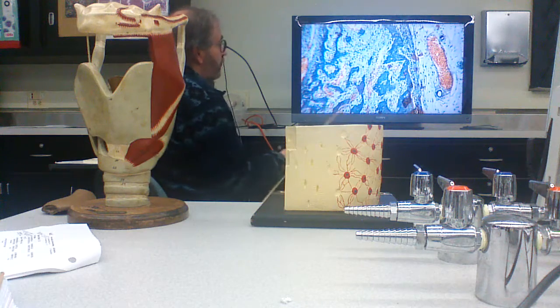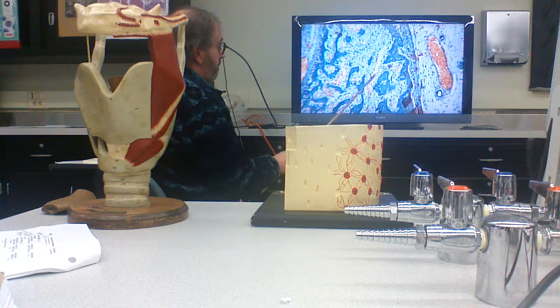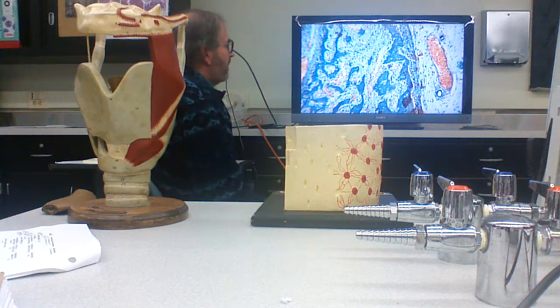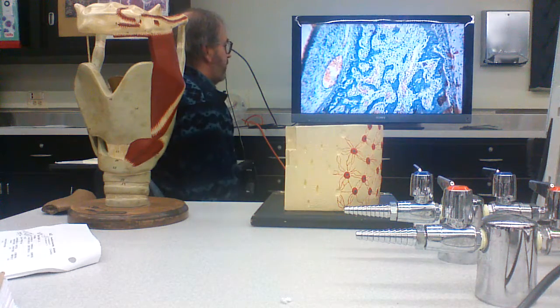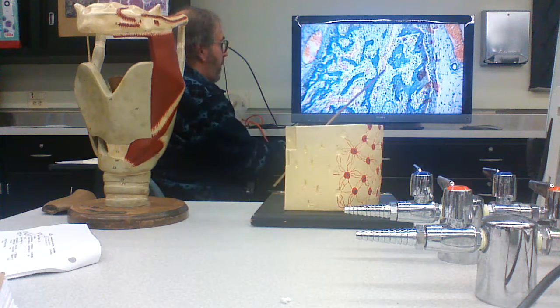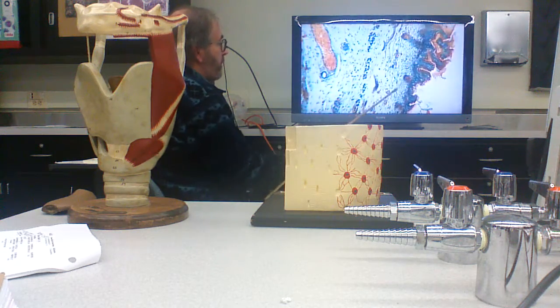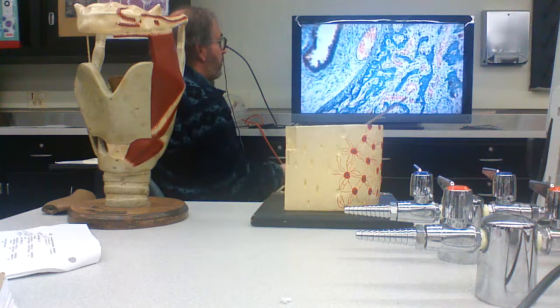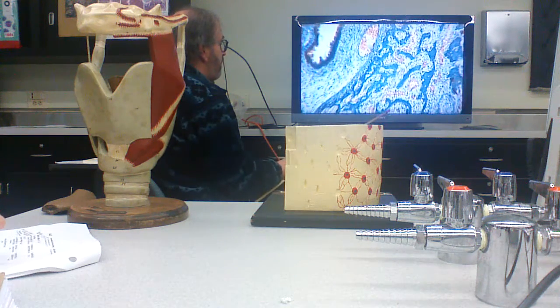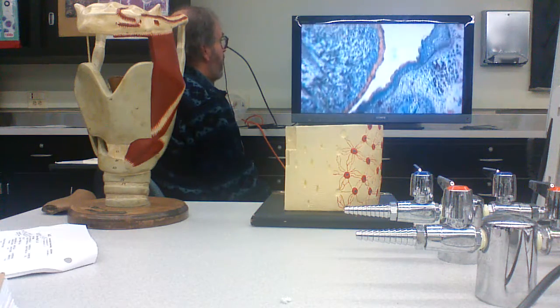And here, this is nicely stained, because the erythrocytes, which are in the vascular system here, look kind of brownish orange, very characteristic for this stain. And you can see that the blood vessels cause a differentiation of these mesenchymal cells, which occur between the skin and other parts. And these guys would then cause the differentiation of osteoblasts. You start making bone plates, and there's all kinds of things going on here.